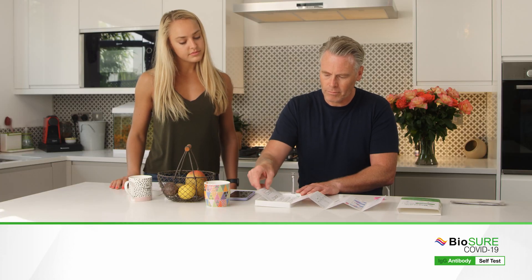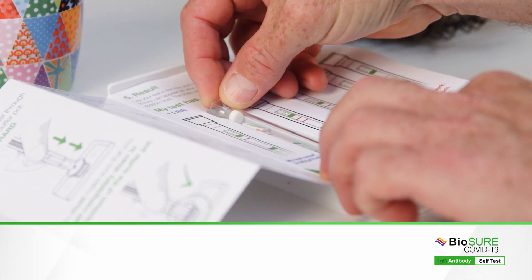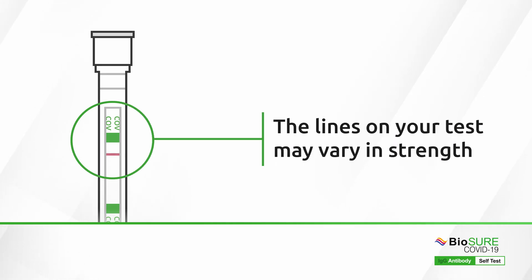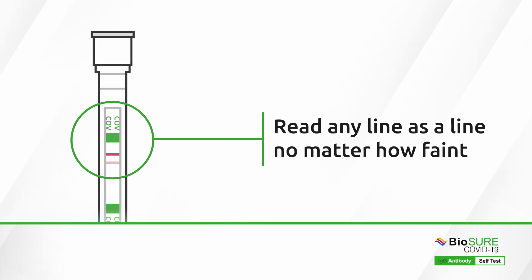After 20 minutes have passed, take your test and lay it in the space in the tray — this will help you to read your results. Please note, the lines on your test may vary in strength and you should read any line as a line, no matter how faint it is.